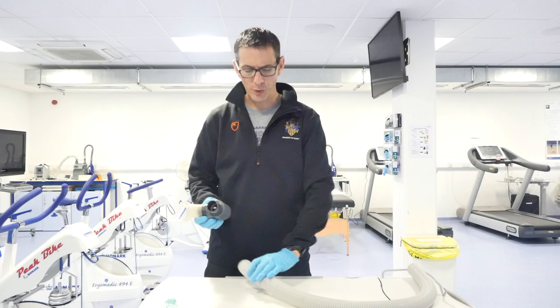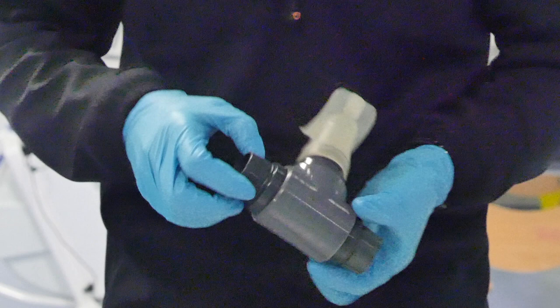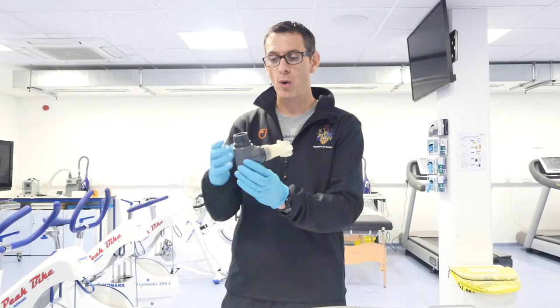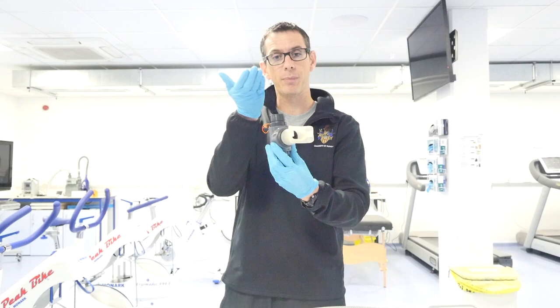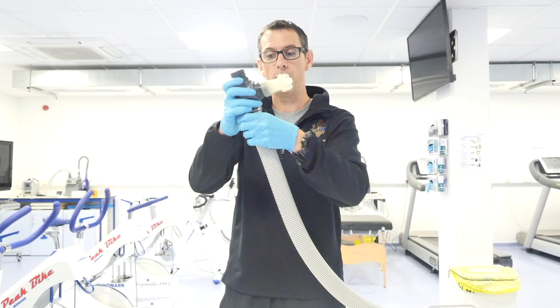In terms of which end to connect the tube, if we look into the system, we can see on one end there's a spring that I can push down, and on the other end I can't push anything in at all. This is important because when the participant has the mouthpiece in their mouth and they breathe in, they draw air from the atmosphere. That pressure when we breathe in causes the spring to come down to draw air into the valve. Then when we breathe out, it pushes down too, so the spring pops back up so the air can't go back into the atmosphere - it's got to go downwards.